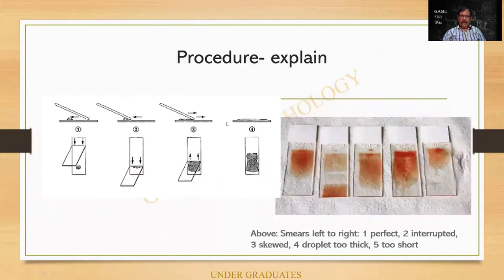So this is again explaining the procedure. You people will have to explain this. In fact, it is not so simple to make a smear. So this is what I had mentioned earlier. I pull a drop over here. I'm pulling it backwards, it spreads by capillary action. Again, pulling it forward so that a smear is made.